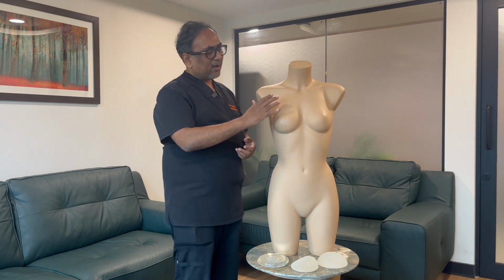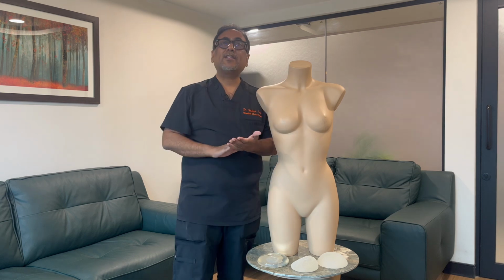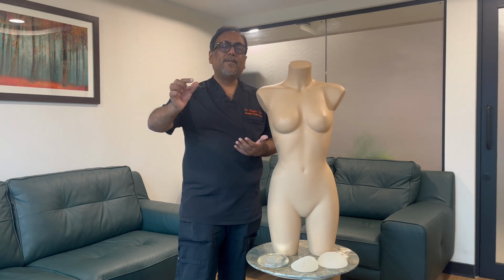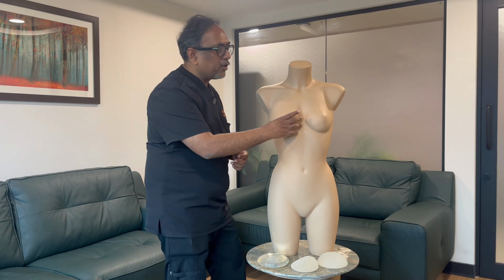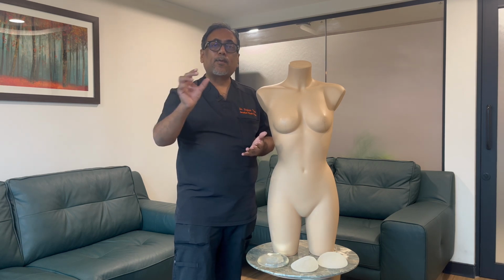Now, once all these things are done, we come to a conclusion by going back to our catalogs. So we know the base width. Based on the base width, we reference the catalog and we come to a conclusion that this is a particular volume which is going to be used for this patient. Now let's say this patient's base width is around 12.5 centimeters. In the reference catalog, that would give us an indicator as to what the approximate volume is.